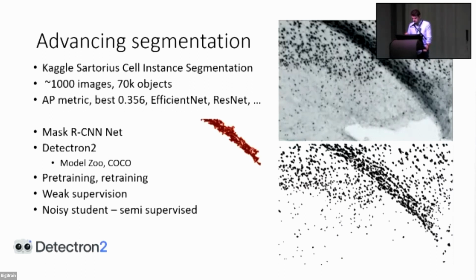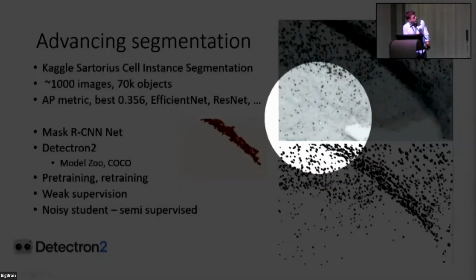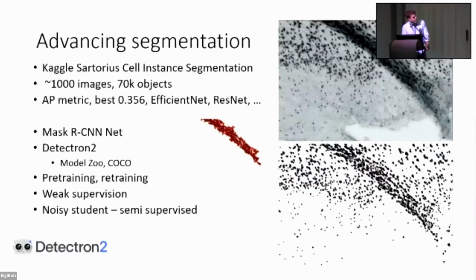This also allows us to detect these tissue problems like this folding, and we can also very easily eliminate those from the training set. Or we can also add them later, so the model can learn this as well. There's also an interesting concept, noisy student, where you have a large network that you then distill into a smaller network that's a student, and then the student feeds its results back to another large network. This is maybe something Professor Kostovic and I can talk about later in regard to dropout and regularization.